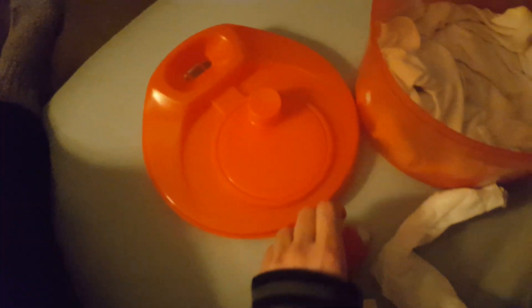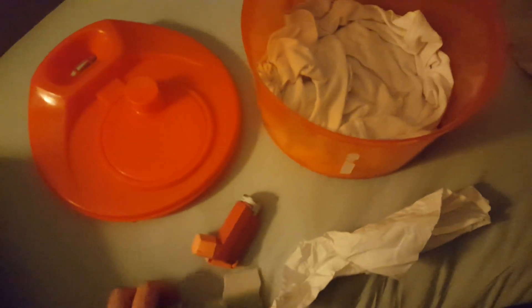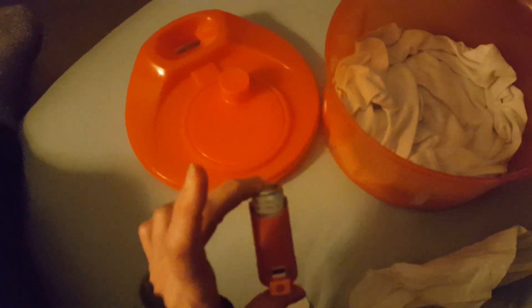Whatever — I'm hysterical right now because my ratty is on his way out, he's not doing well at all. Apparently from another article, anything over eight puffs could be not good for them, so I didn't do more than five. I placed him inside the container and he was a little panicked, so be prepared that he's gonna be stressed. You will need two people to do this.